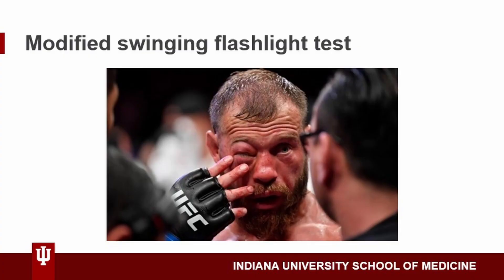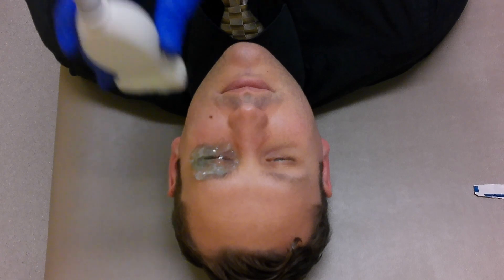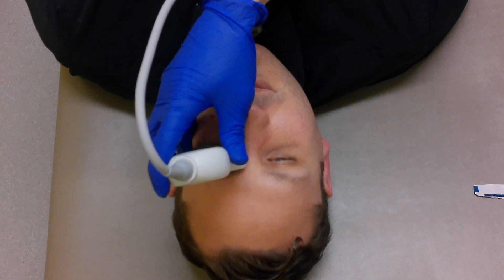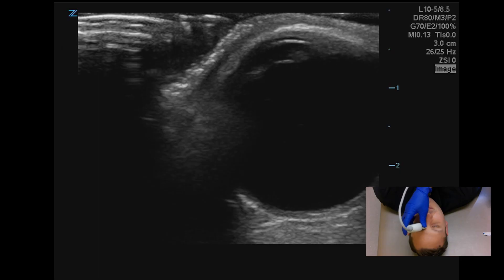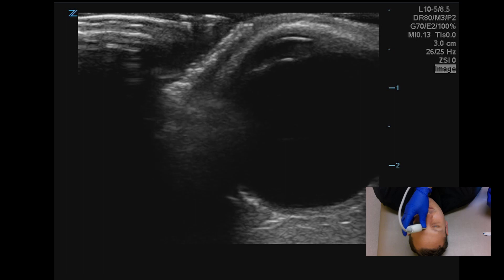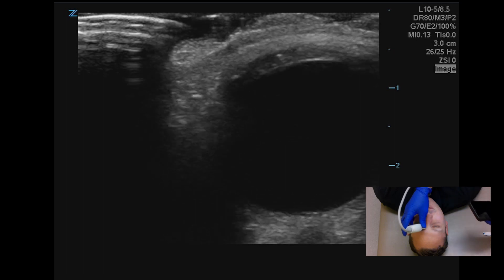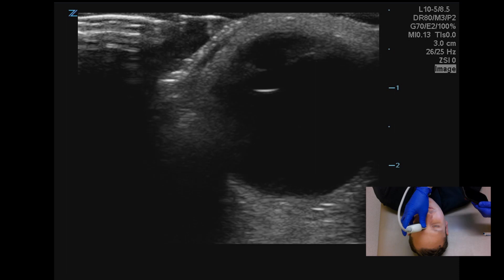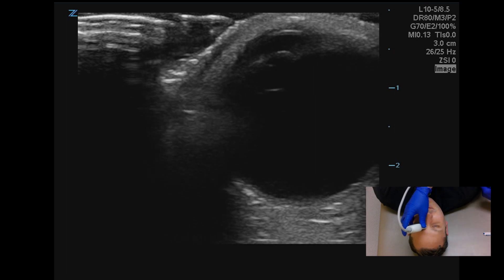In addition to a focused ocular workup, we can also use ultrasound to help supplement our neurologic exam. Take, for example, this patient. After three rounds in the octagon, he's developed some impressive swelling around his right eye that would normally prohibit us from assessing his pupillary function. Using ultrasound, however, we can modify and work through the swinging flashlight test. We'll start with the same setup as described earlier, but this time our probe will be positioned at an acute angle to the patient's eye. Using a shallower depth, we can visualize the pupil and surrounding constrictor muscles. Shining a light into the unaffected eye, we can observe as the muscle contracts in response, demonstrating an appropriate reflex.